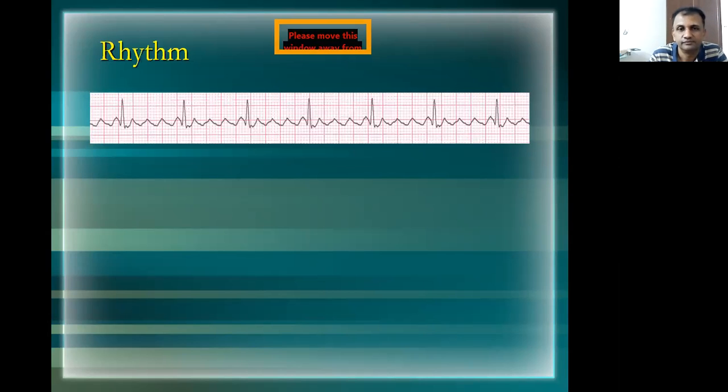This one, atrial flutter. Atrial flutter. Good.